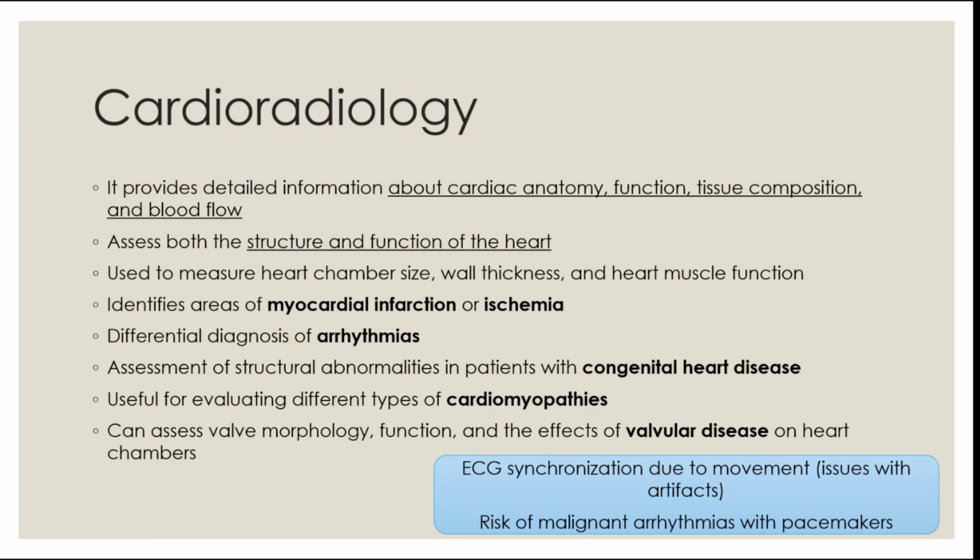So the use of MRI, because I said MRI is not always a first choice, but we can still use it as a part for different organ systems. In cardioradiology, it gives you important information about the anatomy of the heart. You can measure the size of the heart chambers, the thickness of the wall, and you can assess the function of the heart.